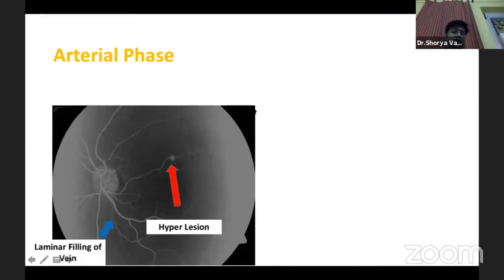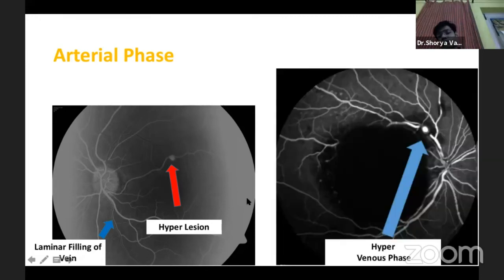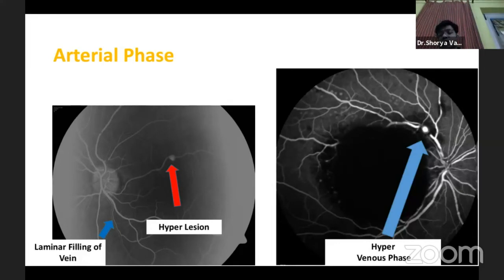Another lesion in the arterial phase: if there is hyperfluorescence along the retinal artery with the corresponding vein showing only laminar flow, indicating it is the arterial phase, that lesion may be a retinal arterial macroaneurysm. A similar lesion present in the arteriovenous or late venous phase would more likely be a venous macroaneurysm.